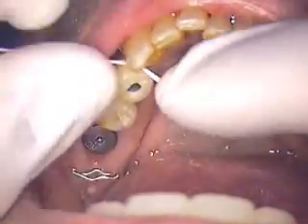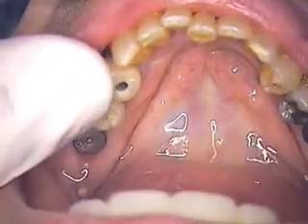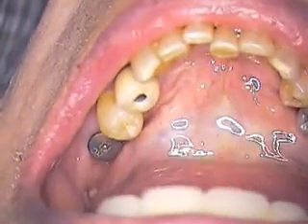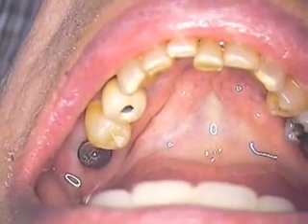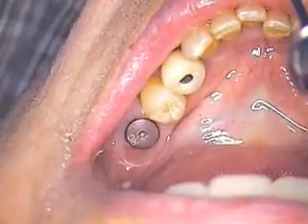We're going to check with our floss — we use Glide Ultra Thin Floss. Of course, if the contacts are very tight, we'll see that floss tear a little bit. Certainly, if it's too loose or too open of a contact, then we wouldn't have any resistance.